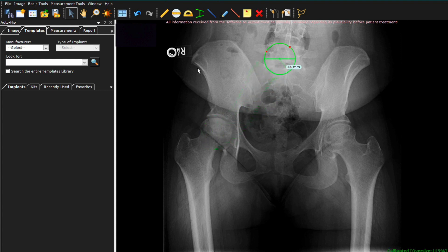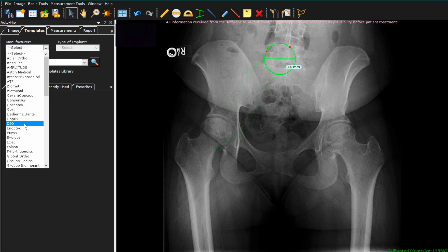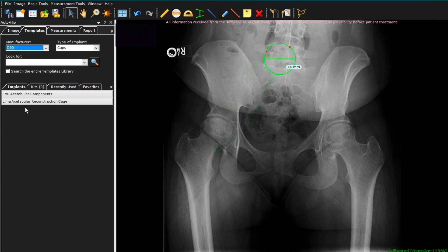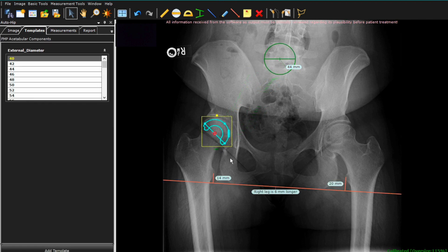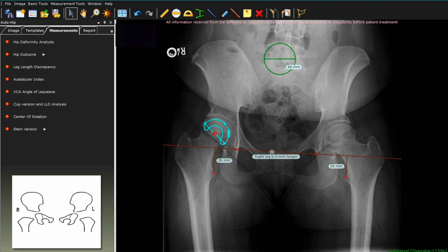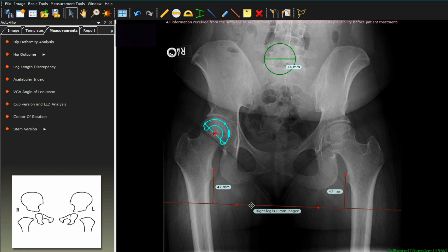We will now go and select the implant we're going to use. I like to begin templating on the cup side, so we'll go ahead and select that cup. When you select your cup, this also pulls up your leg length tool. I will look for the teardrops if they're visible and set the line flat off of the teardrops. If you don't have teardrops, you'll have to use the ischial tuberosities. We'll then adjust the dots so they're in similar locations on the lesser trochanters, and if these aren't available, you can use the greater trochanters.